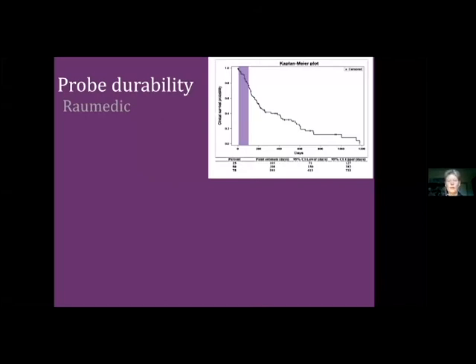We found that the probe non-functionalities within the first 3 months within the purple bar were many reimplants. So we modified our procedure for reimplants not to reimplant in the exact same site if we needed continuous measurement after one probe had discontinued its function.